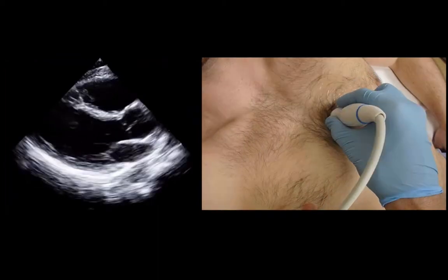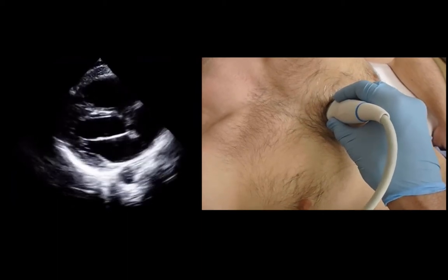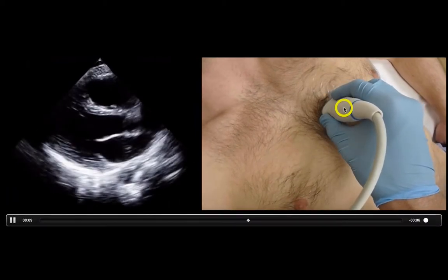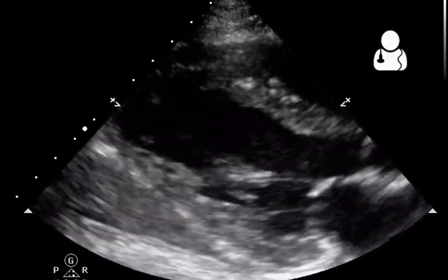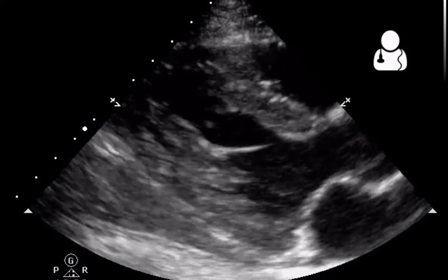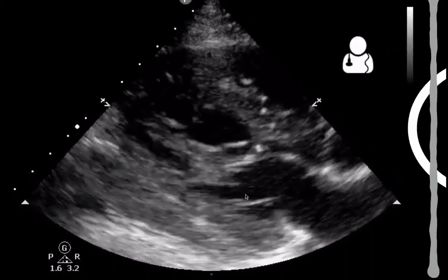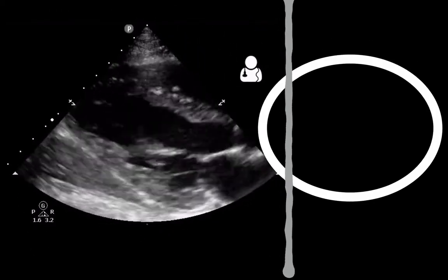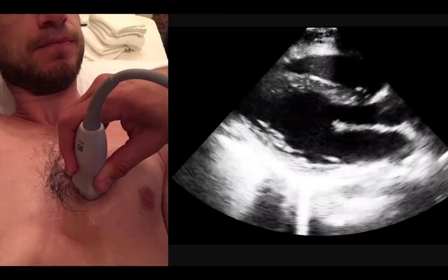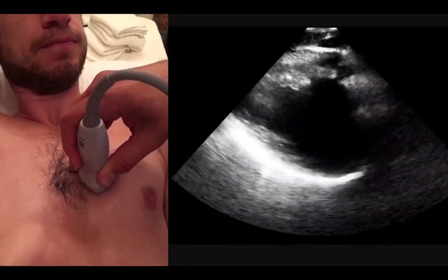One thing that can happen when looking for the parasternal long axis is you can be a little oblique — you get a view where you're not seeing the full chamber. If you get a weird oblique view, just rotate the probe slightly and it'll open up that left ventricle. Another pitfall is slicing the ventricle in an oblique orientation, where the walls appear to be completely touching. To fix this, move the probe side to side until you get the biggest chamber size you can — that's how you know you're in the center of the ventricle and not off to the side.